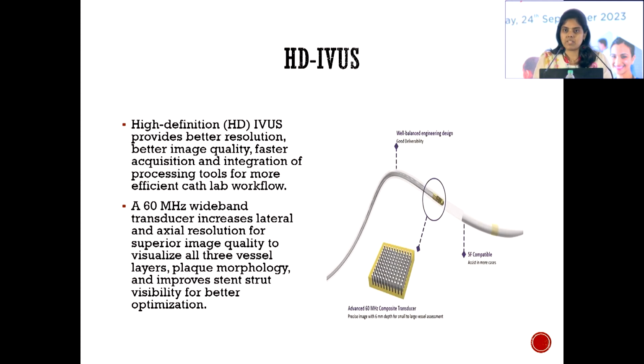And HD IVUS is basically like your high-definition TV, more resolution, more lateral and axial resolution, faster, better quality, and more integration, faster acquisition of images.